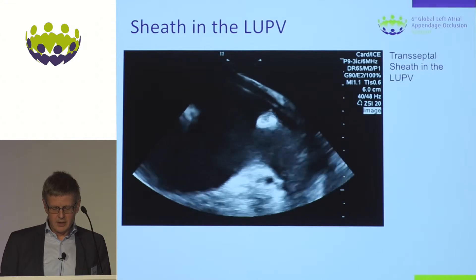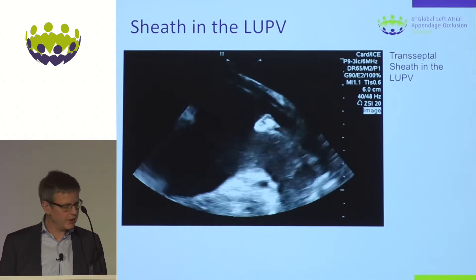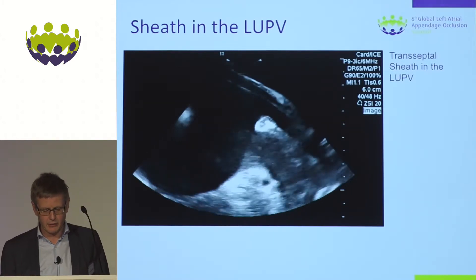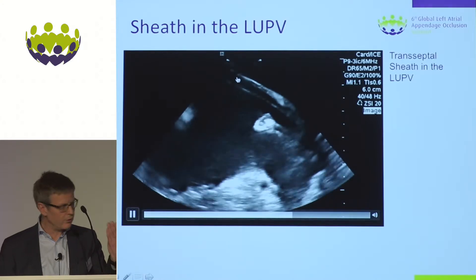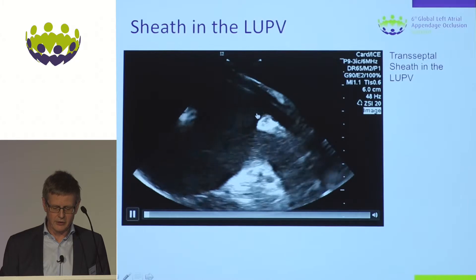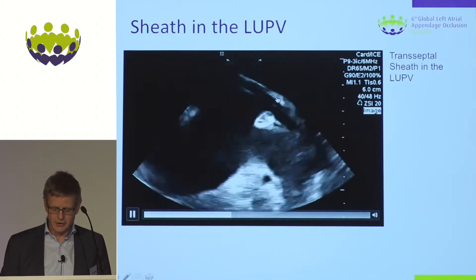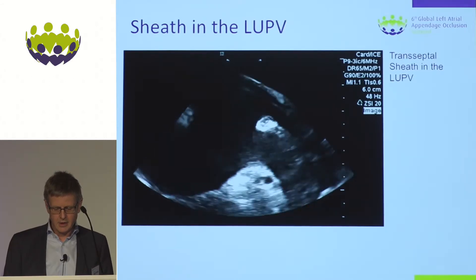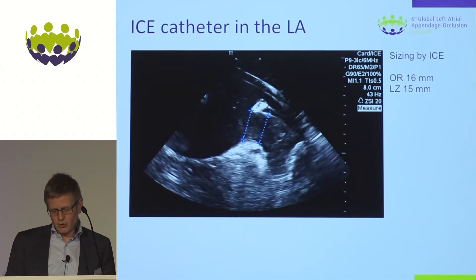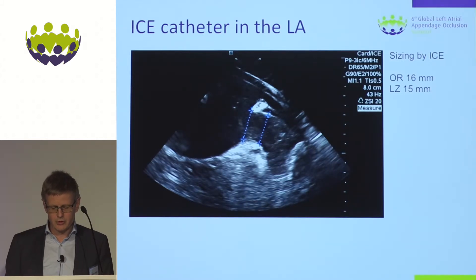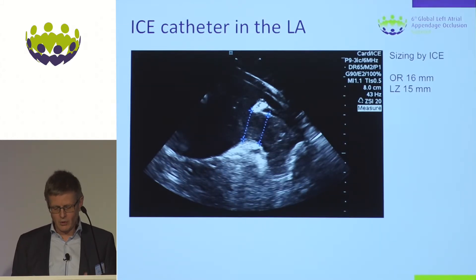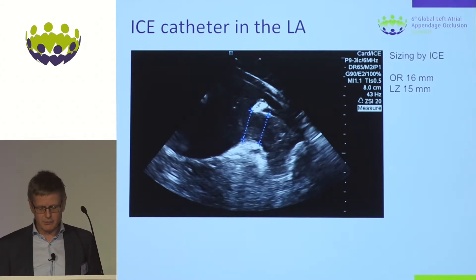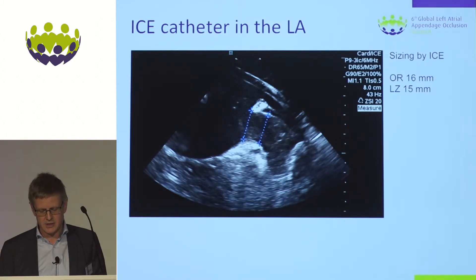The next step is to exchange the transseptal sheath with the delivery sheath, advancing it into the left upper pulmonary vein — easily visualized with the ICE probe. Retracting and angling the ICE probe slightly posteriorly lets you look into the entrance of the left upper pulmonary vein with the delivery sheath of the Amulet device inside. If desired, you can also perform supplementary sizing by ICE, though I don't find this as meaningful as using pre-procedural CT, which takes care of all sizing the day before the procedure.